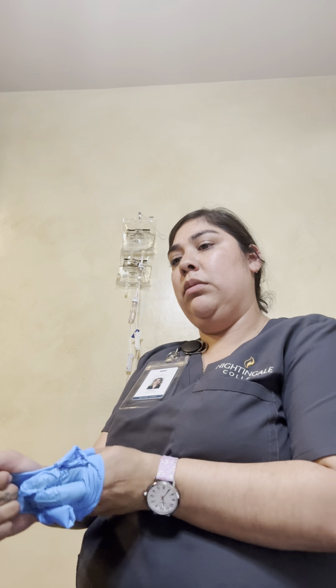We'll make sure that the patient is aligned in a comfortable position, give them their call light. And we would check and monitor the IV site to make sure, again, there's no swelling, no redness, the IV site's intact, there's no bulging, there's no infiltration. She's not having any reaction. We will clean up our supplies. We will perform hand hygiene. And we would document what we did. Thank you.